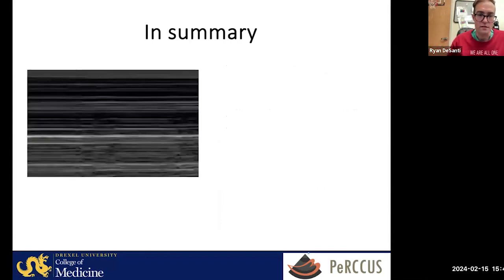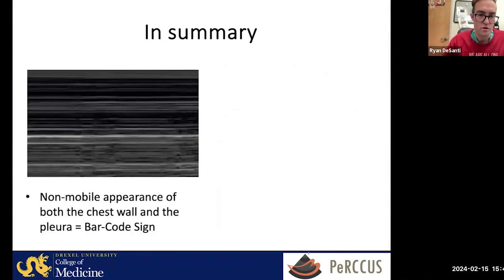And then assessing the pleural line, which can be abolished in many disease processes, including inflammation, pneumonia, anytime the pleura are not opposed to each other, such as in pleural effusion or in pneumothorax.